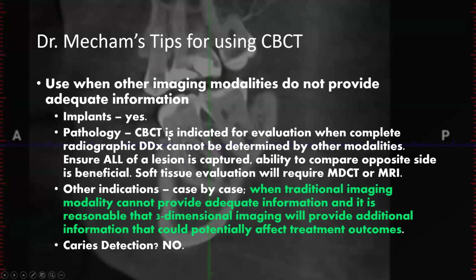All right, pathology. In a lot of cases, it'll be indicated if there's any question in the diagnosis, if it's going to aid your differential diagnosis. I would say in some cases, they're more straightforward, right? What do you think about if you see an antral pseudocyst in a pano, it looks just like every other antral pseudocyst you've seen. Do you want to send that for pathological analysis? I would say no. Those are so common.